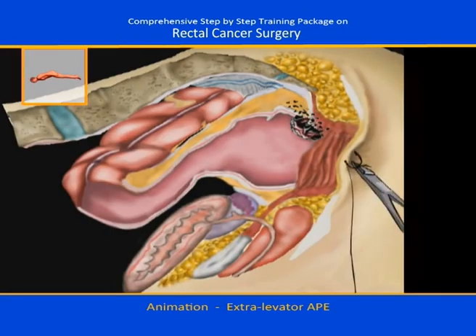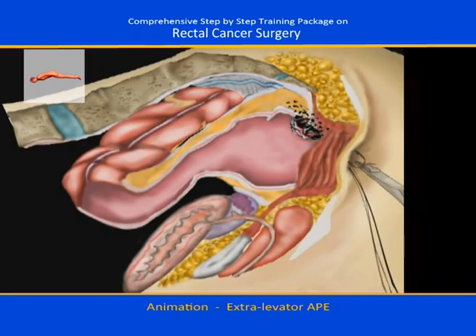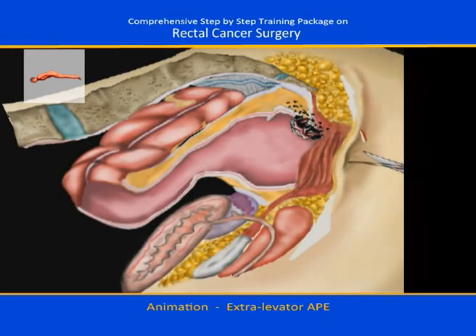Now, let's observe the perineal dissection planes in sagittal view. Patient is turned back and the posterior dissection under direct vision is started. Surgical incision from the coccyx to the perineal body is performed around the anus. The posterior dissection is carried out between the ischianal fat tissue and pelvic floor muscles.